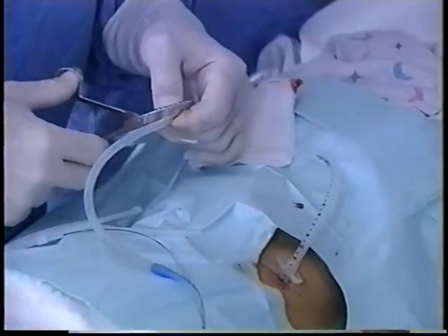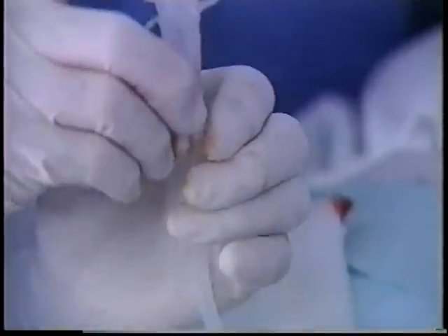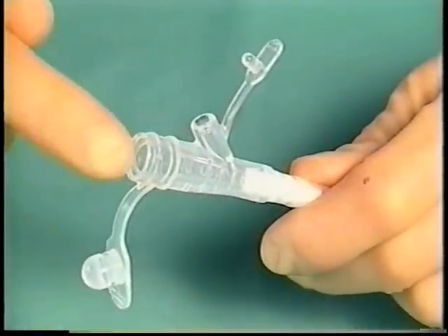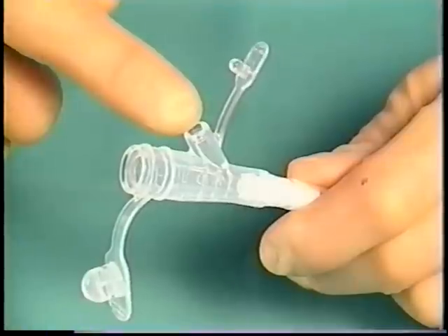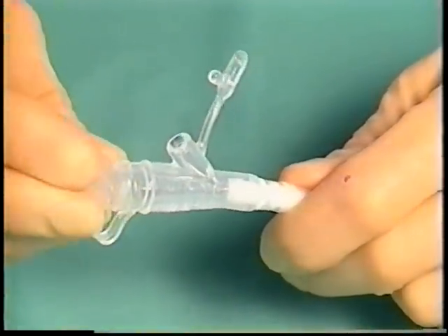The PEG tube is cut to a comfortable length for the patient. The external Y adapter for feeding is plugged into the open end of the tube. The larger arm is the port for the formula, and the smaller arm is the port for administration of medications. The caps on both ports should remain closed, except while in use.